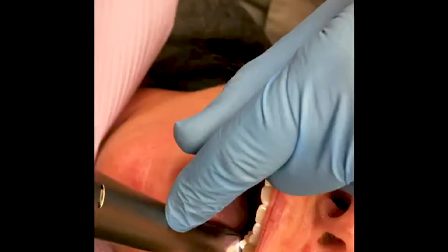Hi everybody, Jackie here with Dr. Lauper from Coshocton Dentistry. How are you doing today? Doing great, how are you? Doing great. So today we're going to talk about how your office can do a CEREC crown in one day. You have a great video to show this, so let's take a look.